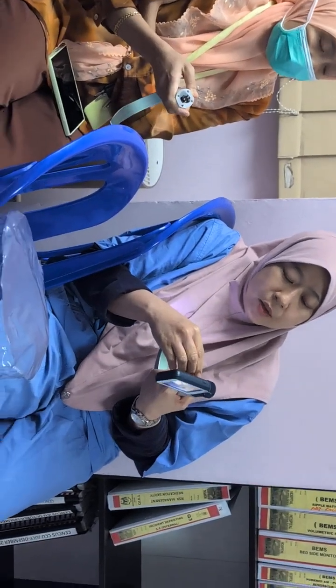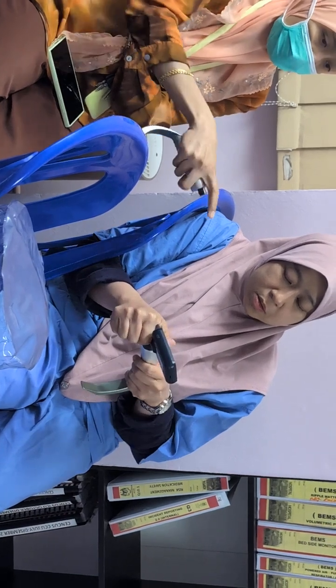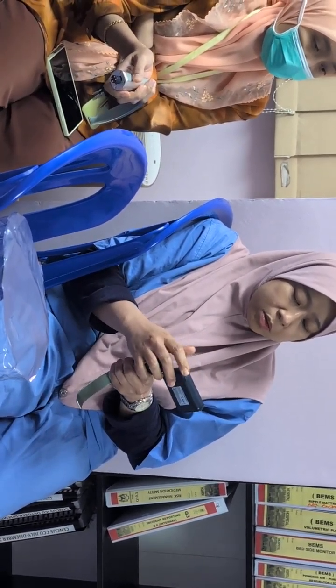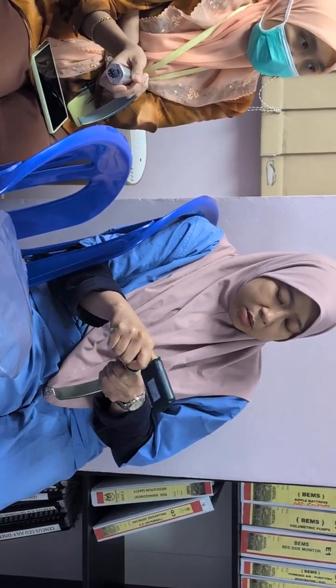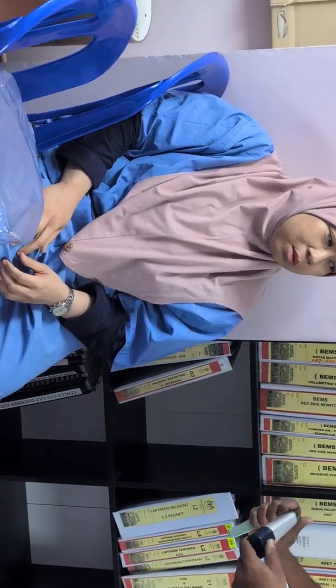Nak buka balik? Doktor nak buka balik body to body. Doktor off dulu kat atas tu. Okay, and then body to body, just twist. Twist it. To the right. To the body to body. So kita will hold.